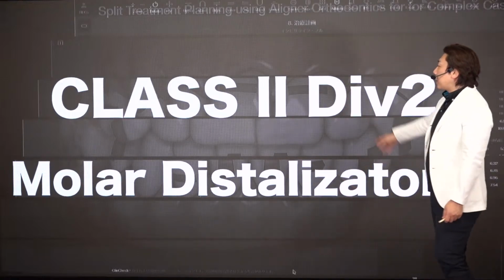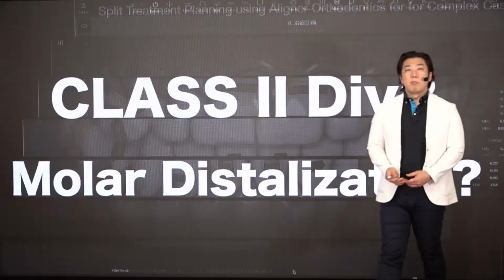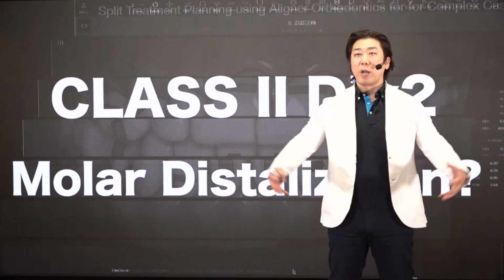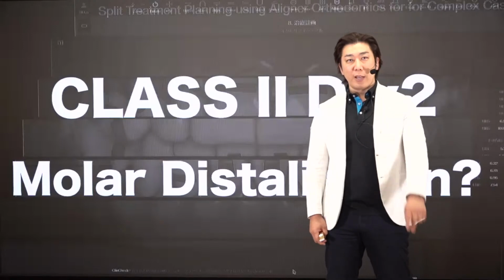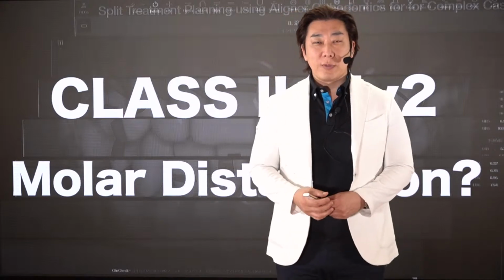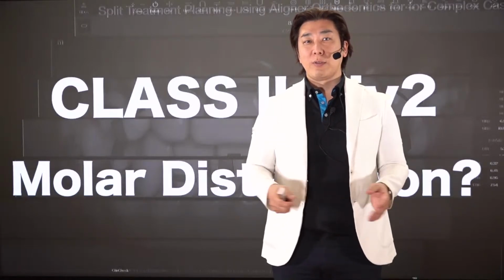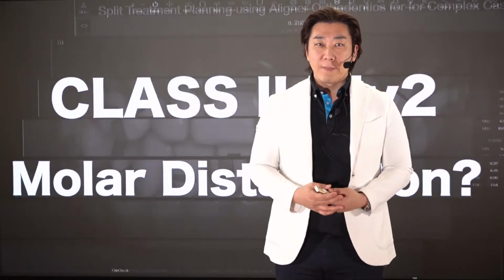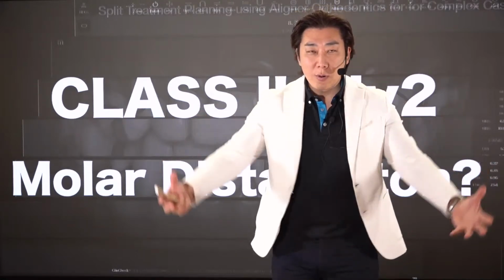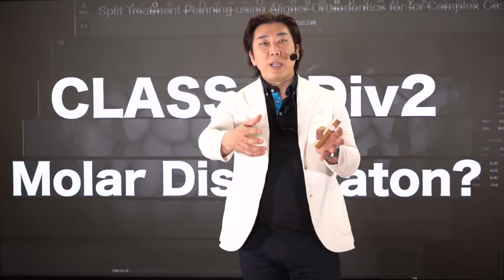Then after that, how can we do class 2 division 2 molar distalization? The molar distalization is some of the time a very difficult approach because the molar is big and has many roots. Some of the time we need a mini screw to control molar distalization more easily. But aligner is totally different. Why? Aligner is gripping the molar, gripping the crown, holding all aspects, then slightly moving completely, very fast.